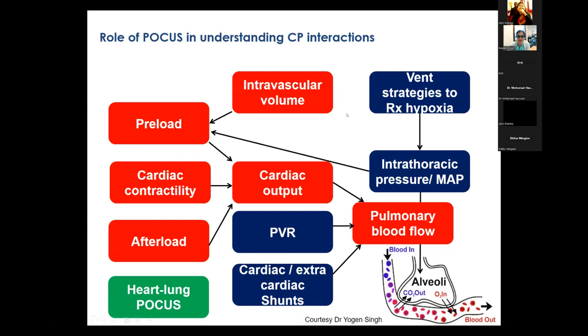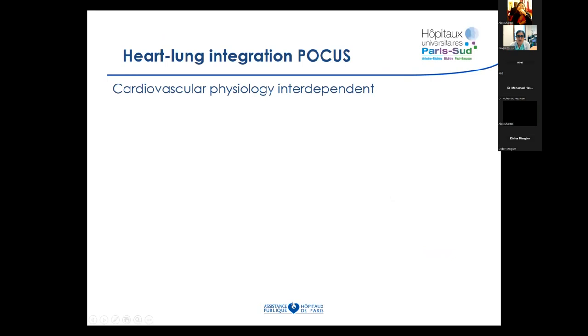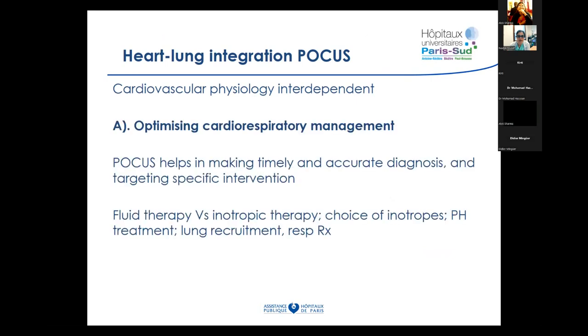We have a patient with hypoxia, and we could start off either, let's say, that we are in a position where we have decompensating patients or patients we're treating. And this is where point of care ultrasound seems to be very interesting, because it gives us a number of insights that we would not get otherwise by chest x-rays or clinically. For example, if we're doing cardiac POCUS, it might help us in our choice of management.